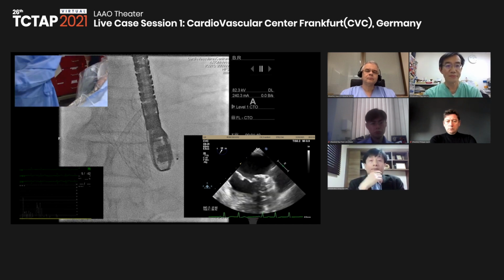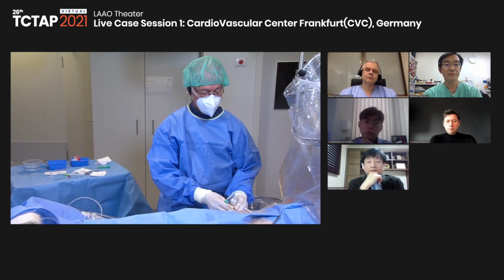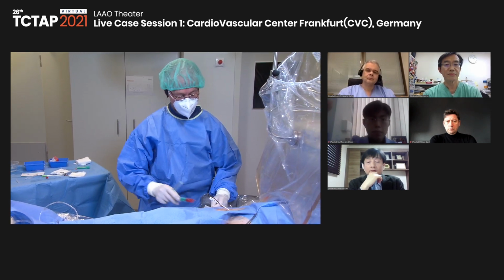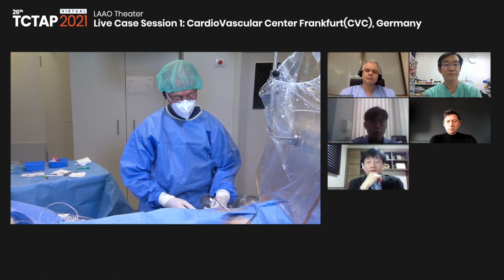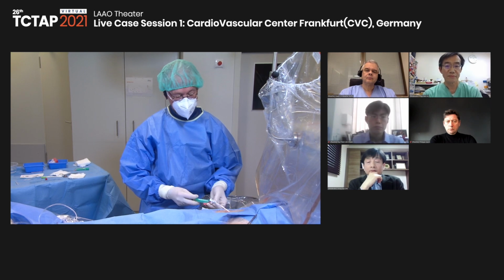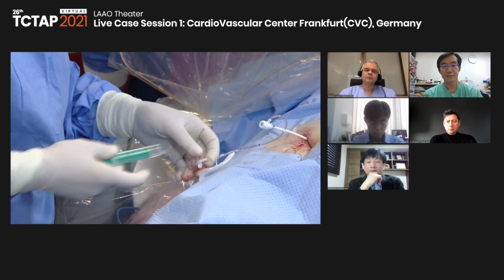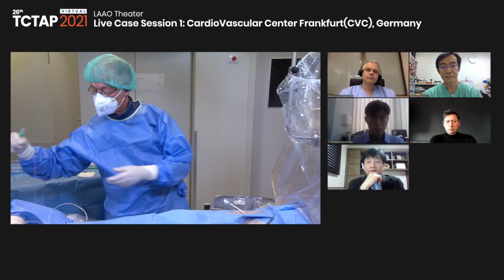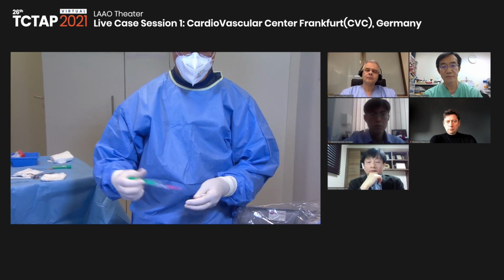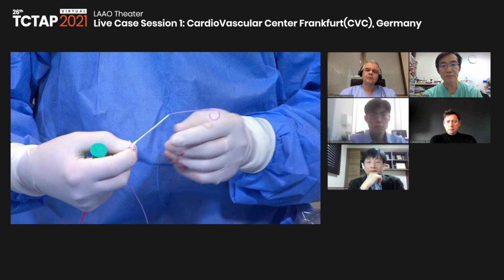At this time, I will give heparin. We usually give 10,000 units of heparin, independent of body weight. But if the procedure takes longer, then we check ACT, but not routinely, because with 10,000 we are almost always in the range where we want to be. So the next step is to go to the left atrial appendage with an angled pigtail catheter. I think he needs more sedation. I like to use the 4 French angled pigtail because the tail is smaller than with the 5 French.